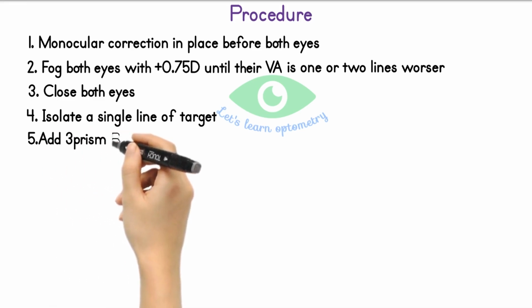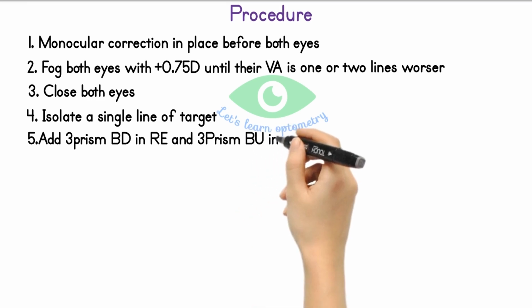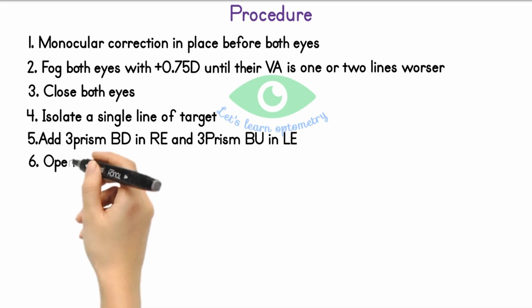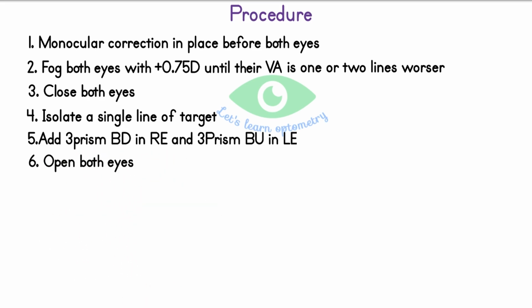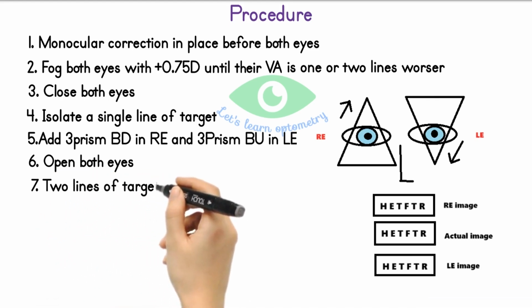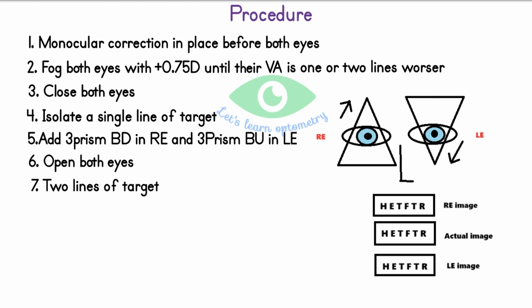Now add 3 prism base down in front of right eye and 3 prism base up in front of left eye. Some practitioners prefer using 4 prism instead of 3. Either can be done, but please make sure both eyes have equal prisms. After placing the prisms, ask the patient to open both eyes. They will be seeing 2 lines of targets, one above and the other below. We place base down in front of right eye, so the corresponding image will be shifted upwards. We placed base up in front of left eye, so the corresponding image will be shifted downwards.